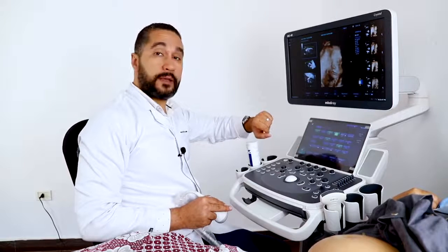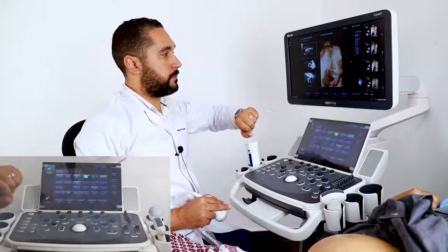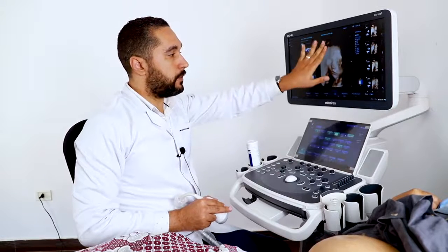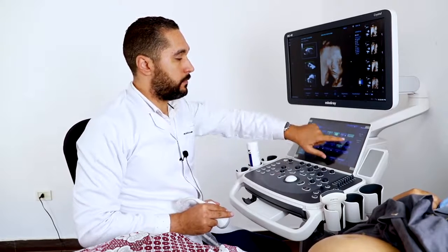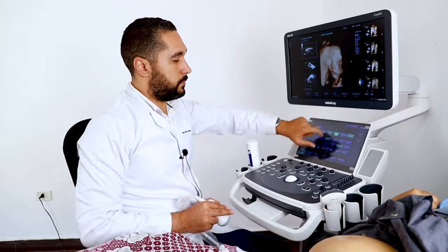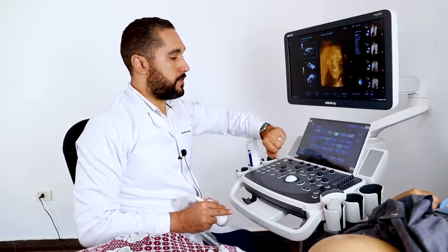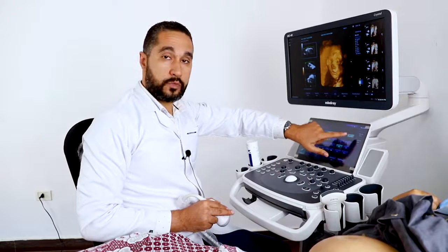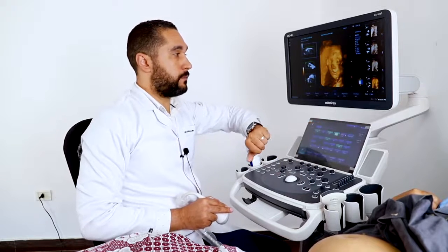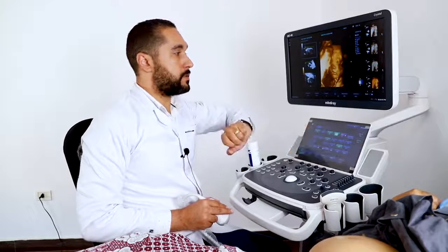Now I'm going to show you the Smart Face feature, both on the iLive and the surface mode. This is the Smart Face — it has removed all the occlusions in front of the face. I'll show it on the surface mode as well. You can see the difference between the surface mode with Smart Face and without.